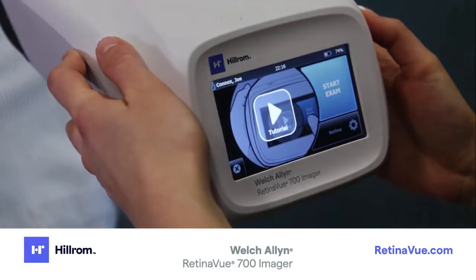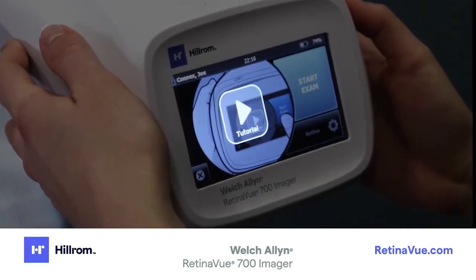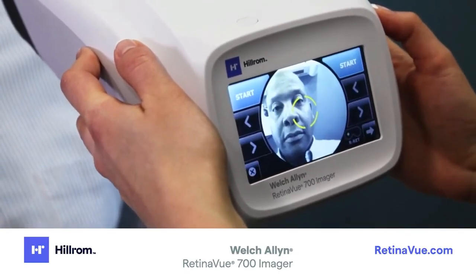If desired, touch on the tutorial to get a refresher on the proper technique to acquire an image. To acquire an image, touch the Start Exam button. You are now ready to acquire an image.